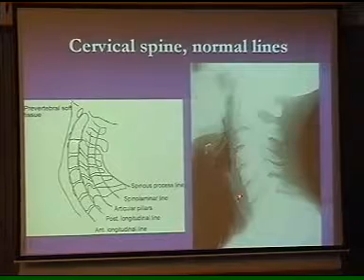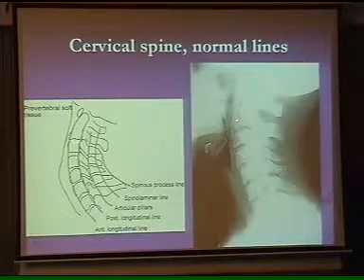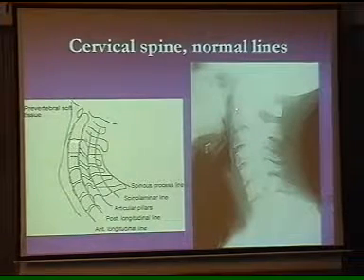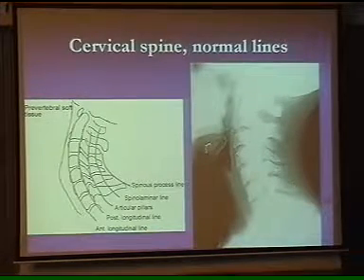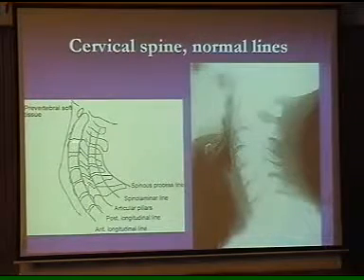But normally it should not be more than 1 vertebral height, and this should not be more than 2 millimeter. Anything more than 2 millimeter, please look for any soft tissue swelling over here, if it's adenoid or tonsils. The detailed history of the patient is very, very important: age of the patient, sex of the patient, and clinical presentation. Sometimes even lab support is very important.